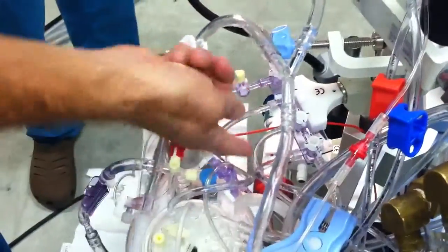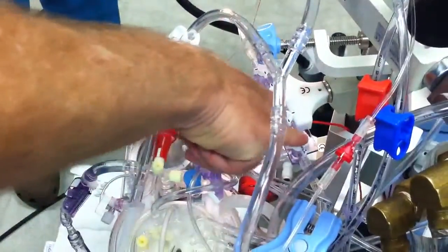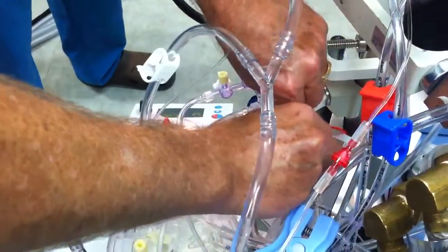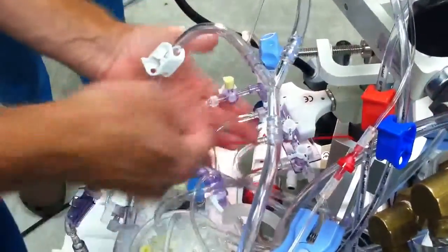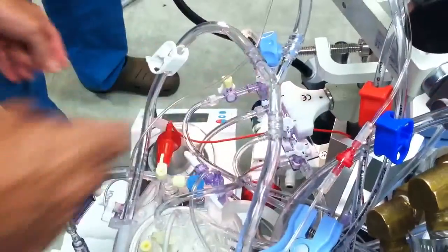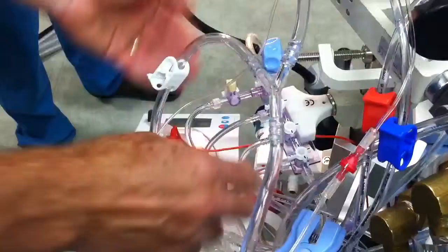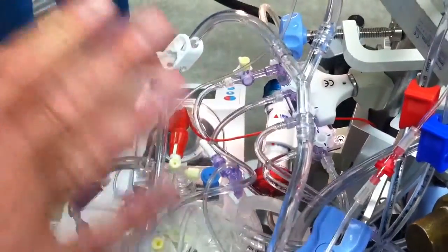So now what I want to do is prime out the second line of the cardioplegia line. I do that by turning this one off and this one tails out at the same time. And here comes the fluid — gone. So those two lines are totally primed. We turn both of them off at the same time, and now we've primed the spider lines from the cardioplegia. They're done.